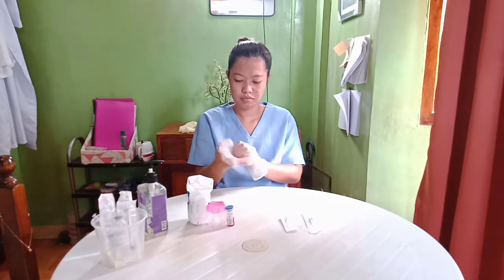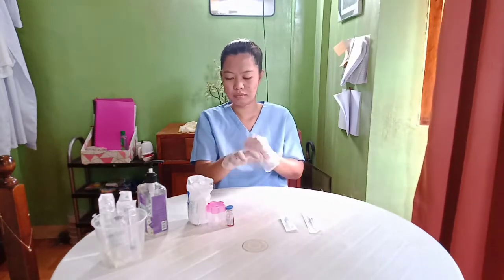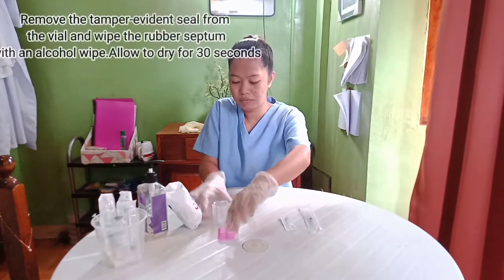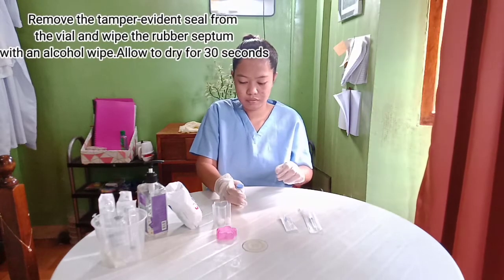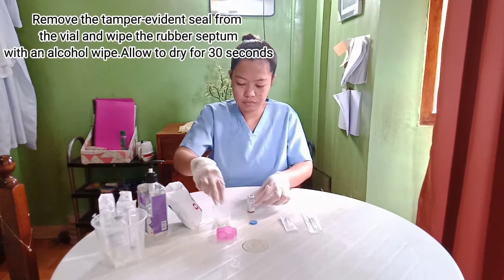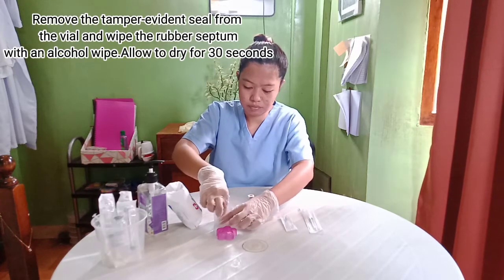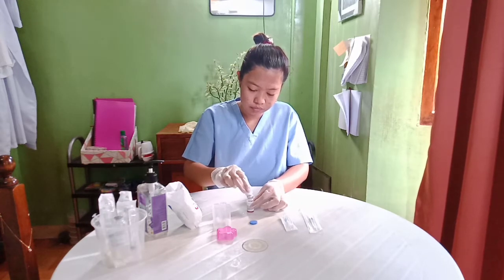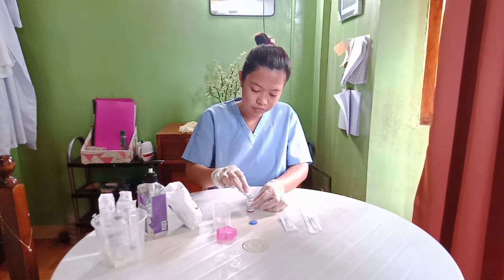Remove the tamper evidence seal from the vial and wipe the rubber septum with an alcohol wipe. Allow to dry for 30 seconds. This will help decrease any contamination.